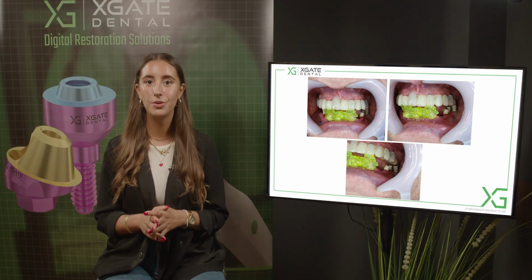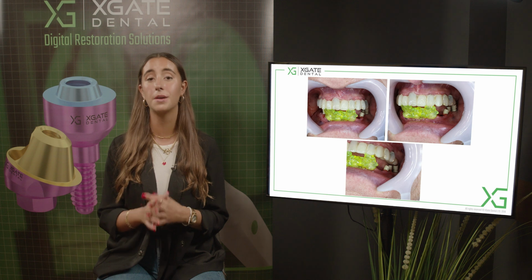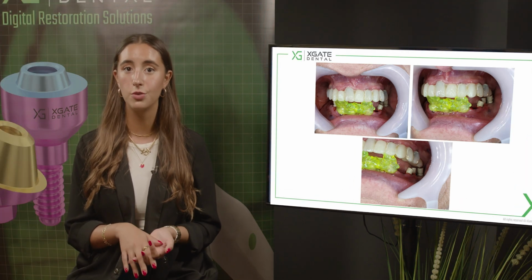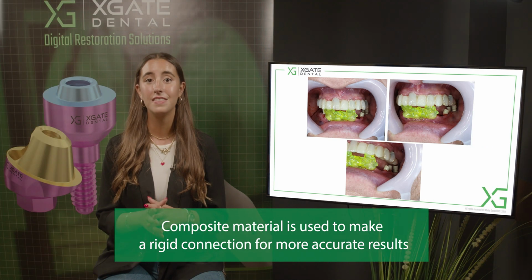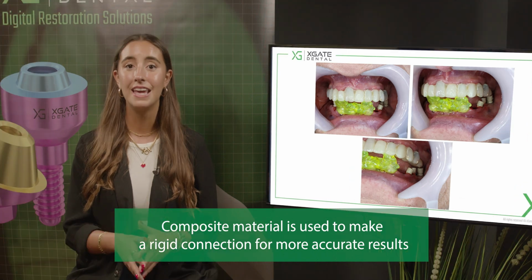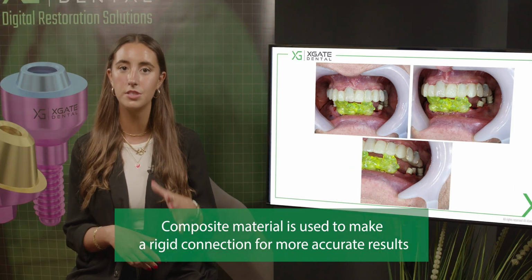Here you can see that we took off some scan abutments and we added composite material on some of the scan abutments. The composite material is in occlusion, and you can see that the height of the scan abutments is exactly 6 millimeters. This is probably the smallest height for the restoration that you want to have. In the anterior part, you have much more. You can see the height of the composite material.